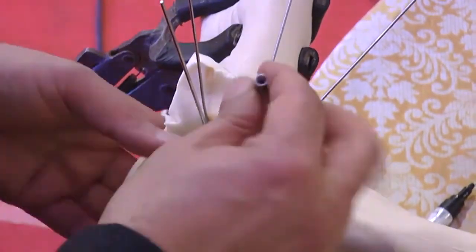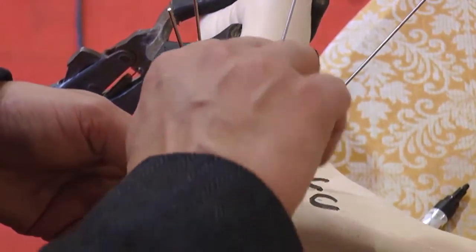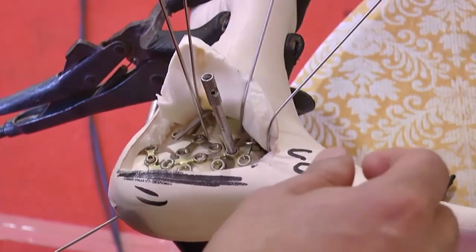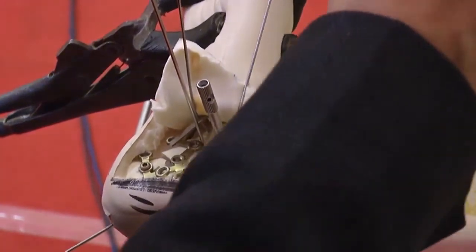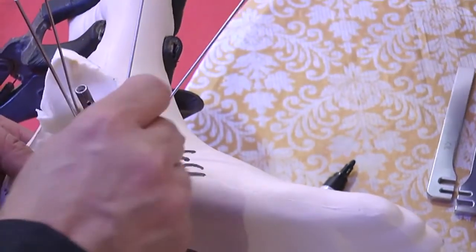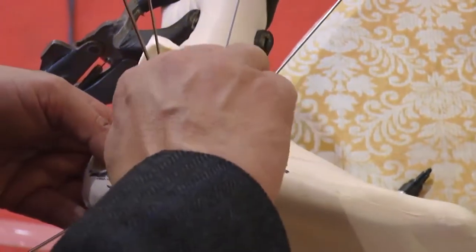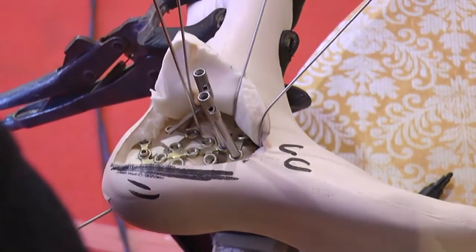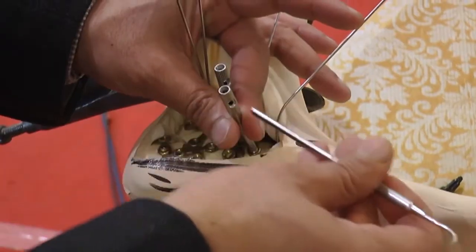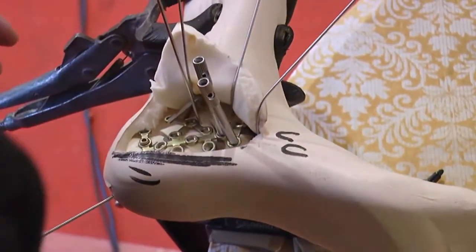Now this plate, it is possible to... one more locking sleeve. You have one more locking sleeve. So you see how malleable this plate is. It is possible to mold this plate. If parts of this plate are lifted off from the bone, you can use your locking towers. Can we have something to tighten this?